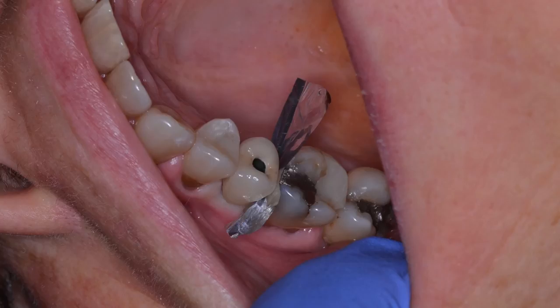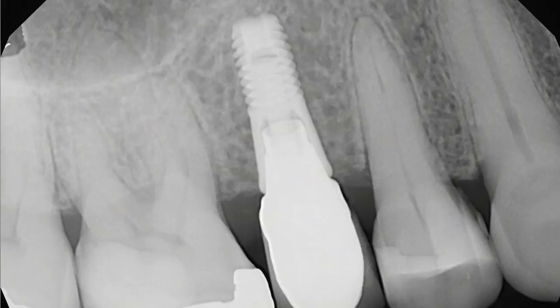In this particular patient's case, the first thing we check is the contacts, then you check the margins, and then you check the occlusion. We've already gone over checking the contacts. The way of checking the margin is to take a radiograph, and you want to see that this crown is seated on the actual implant, with no black line or space.